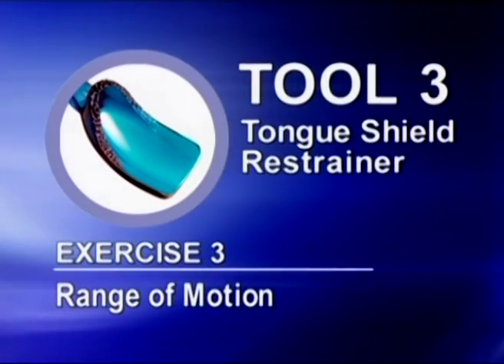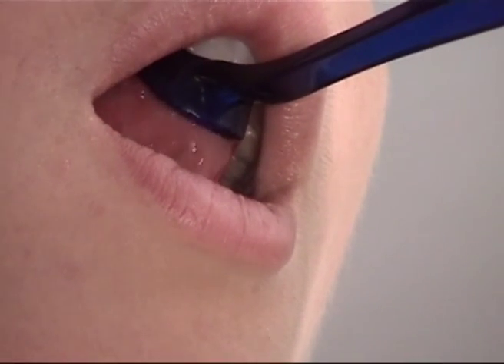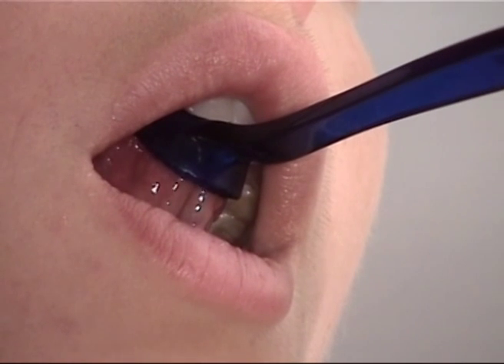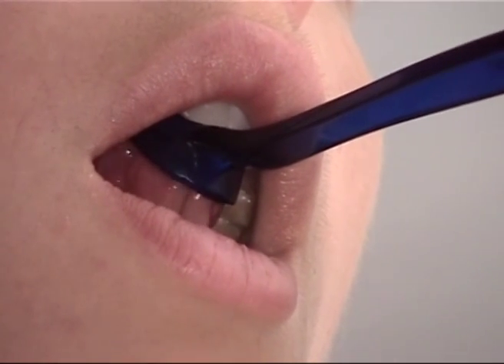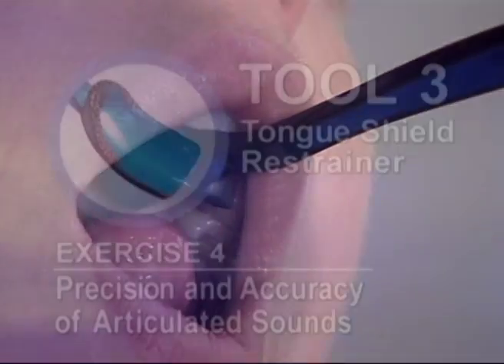The goal of exercise protocol 3 is range and ease of motion. Place tool number 3 on the palate behind the front teeth. Elevate tongue tip against the concave section of the ridge. Lower the tongue tip from the concave section of the ridge. Continue to elevate and lower the tongue tip until the patient experiences fatigue. Record number of elevations within a 10-second period.